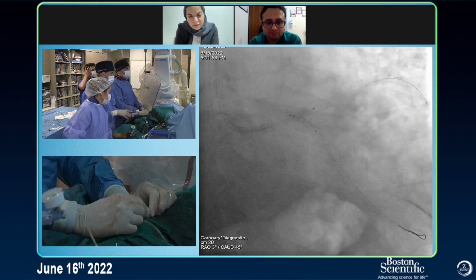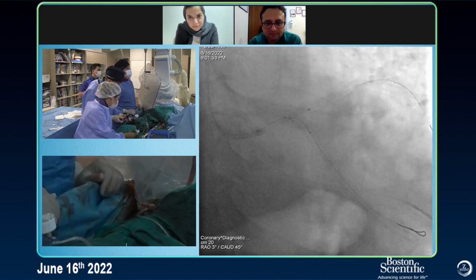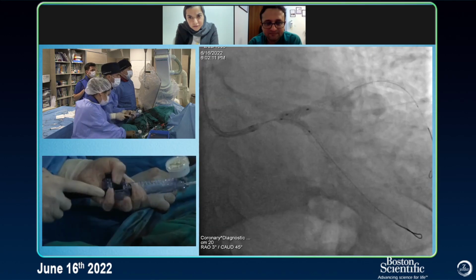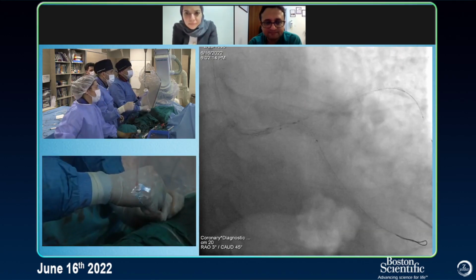And now we do kissing. Wait a little bit and then kiss. Yes. Go up. 2, 4, 6, 8, 10, 12, 14. 1, 2, 3. It's nice kissing. Very nice.